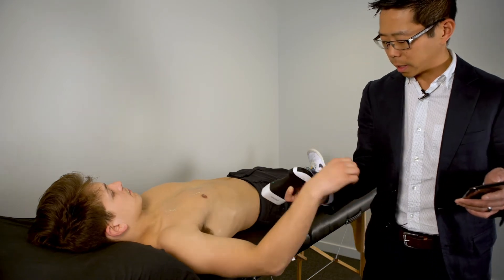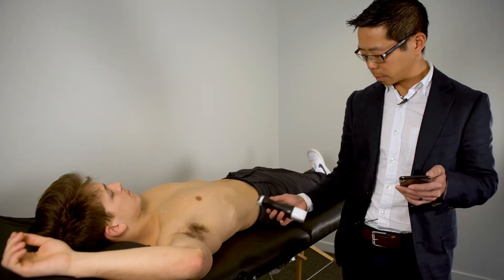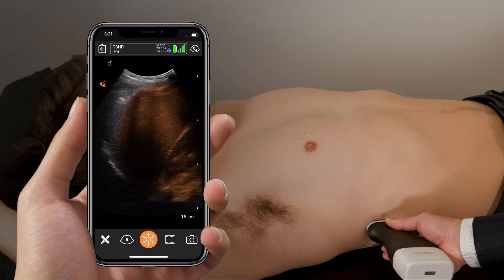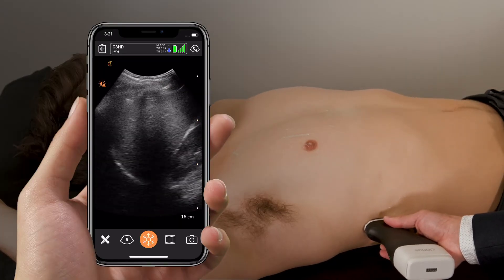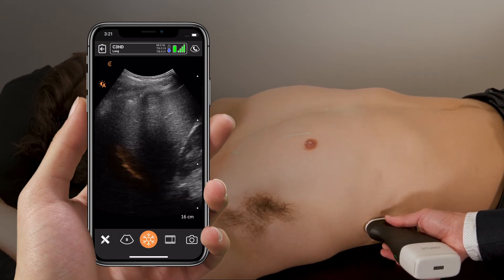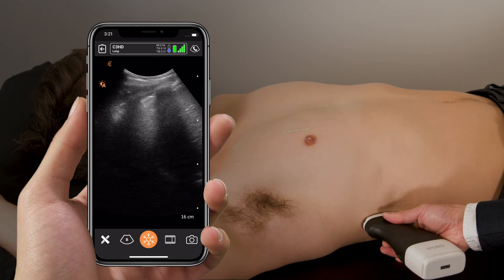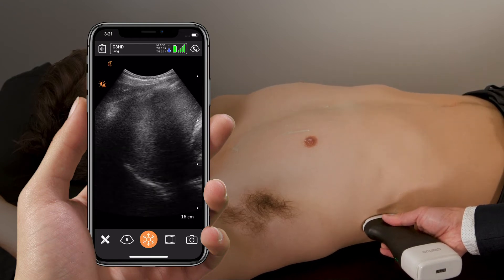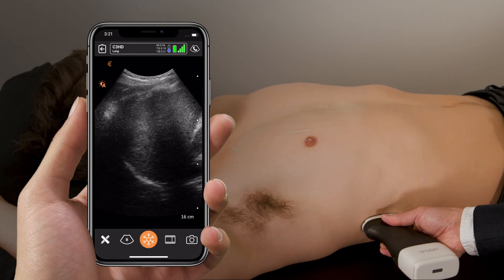For visualizing the axillary area of the lung, we'll start at the liver-kidney interface. The idea here is to visualize the diaphragm, which is the hyperechoic bright curved line above the liver. Here you can angle or slide the probe upwards to identify whether there is a pleural effusion. In this case, there is not a pleural effusion.